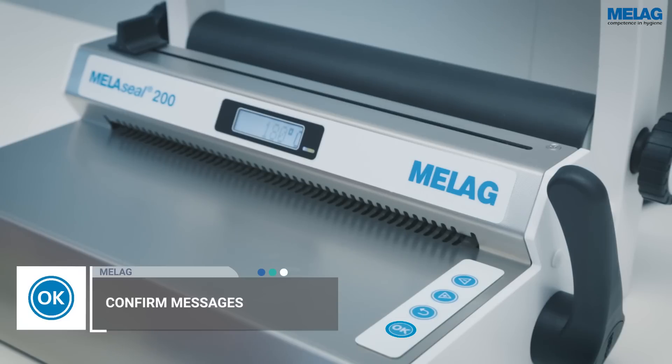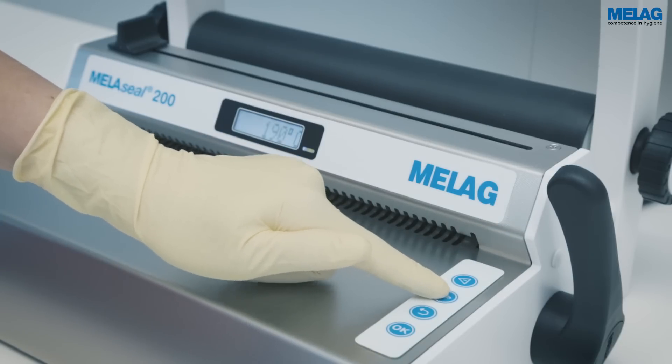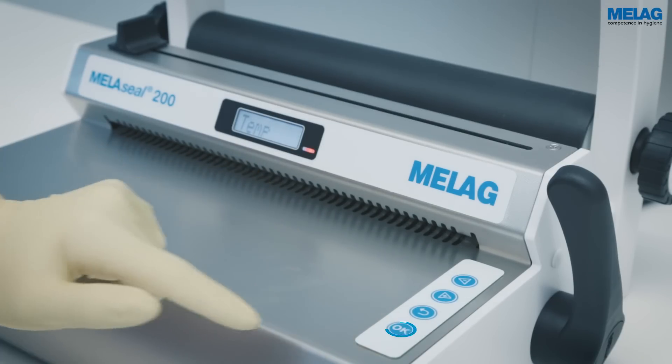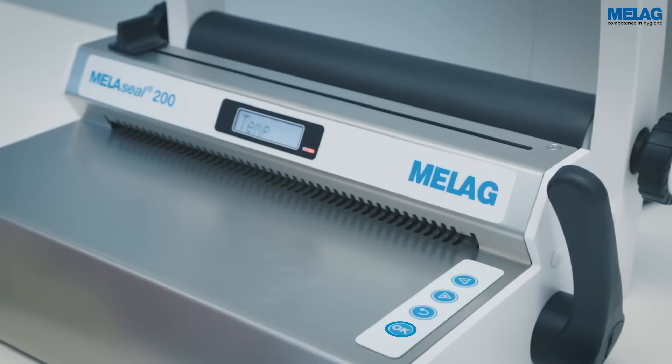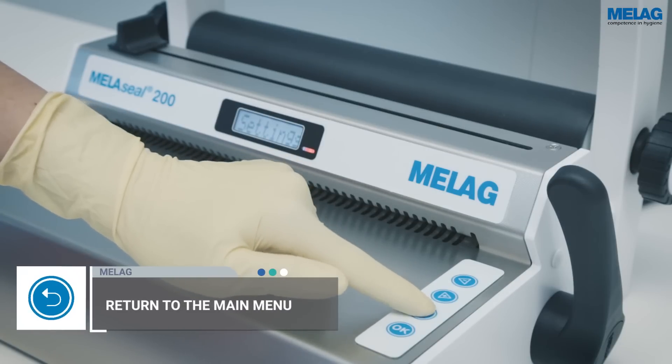The set ceiling temperature flashes. The temperature can be adjusted using the plus and minus keys. Once the desired value has been reached, press the OK key to save the setting. Return to the start screen by repeated pressing of the curved arrow key.